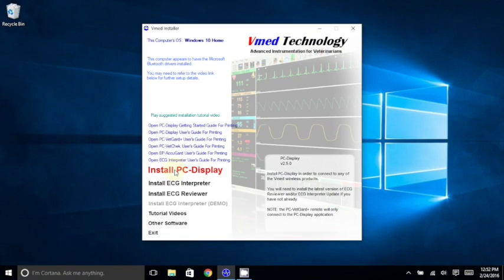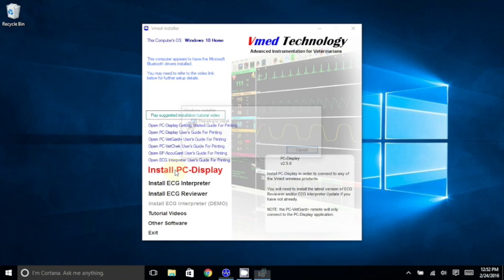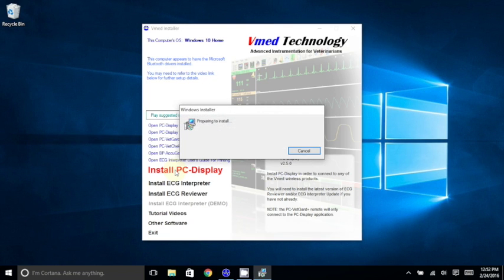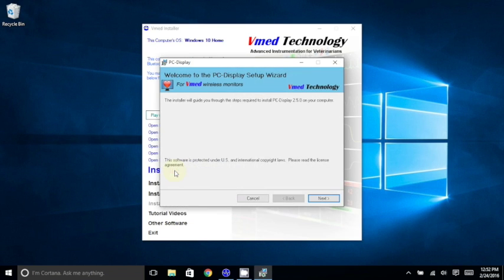Once the installer window comes up, click Install PC Display. On the initial screen, click Next.